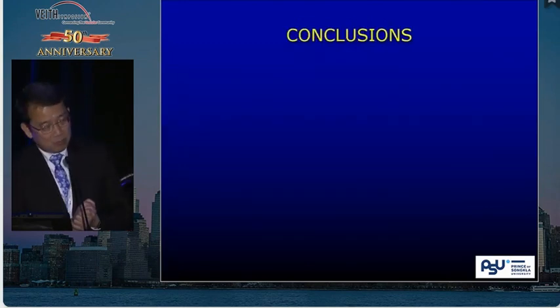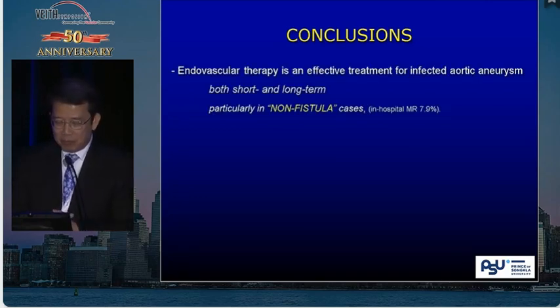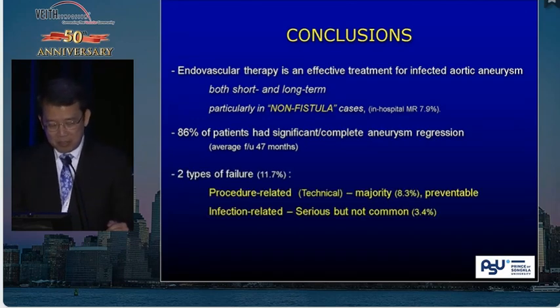So in conclusion, Chairman, ladies and gentlemen, we believe that endovascular therapy is an effective treatment for infected aortic aneurysm, both short and long term. And 86% of the patients during the follow-up had significant or complete aneurysm sac regression. Average follow-up was almost 4 years.